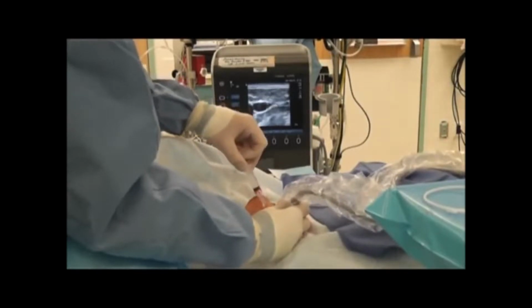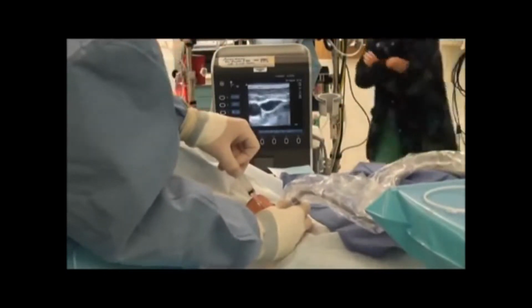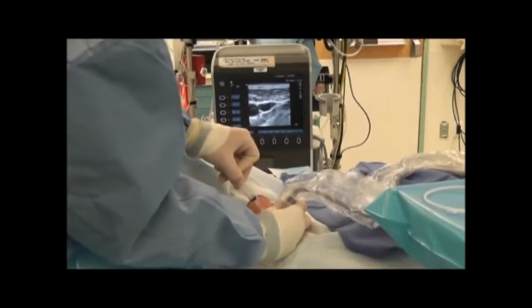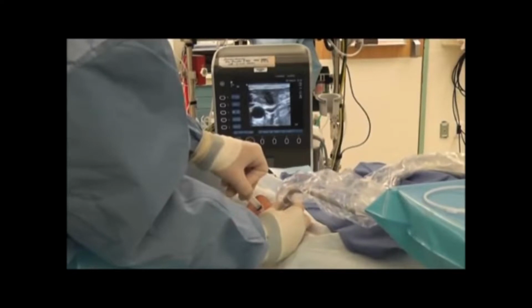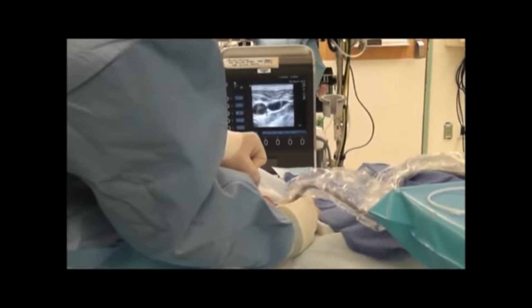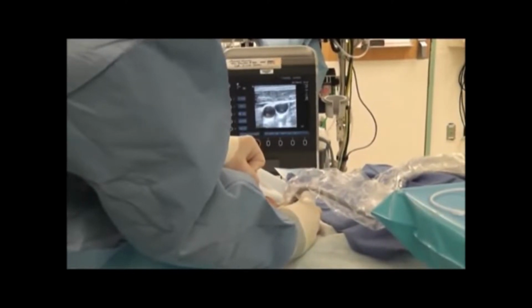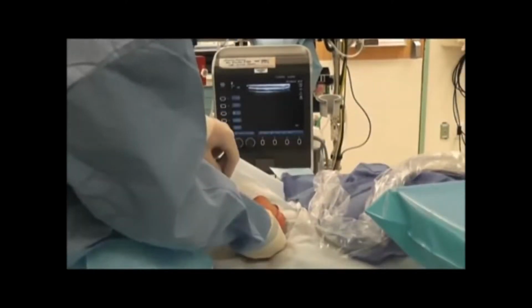Again, as I said, I took this video years ago, and here we're putting a second vascular wire in this patient. You can see slow, deliberate motions, a little lateral there in the vein, and we're tenting the anterior wall of the vein. And there we are entering the anterior wall, very close to the carotid, as you can see, but we have everything under direct visualization. And now, again, the same thing. We got into the vein, got flashback, and then we put the second wire in this patient.